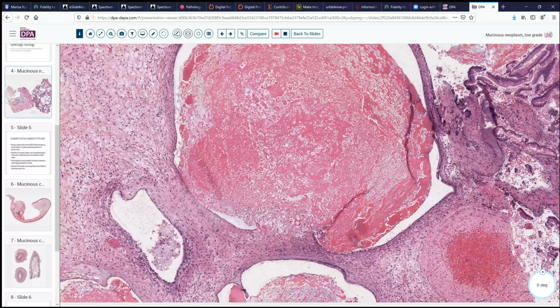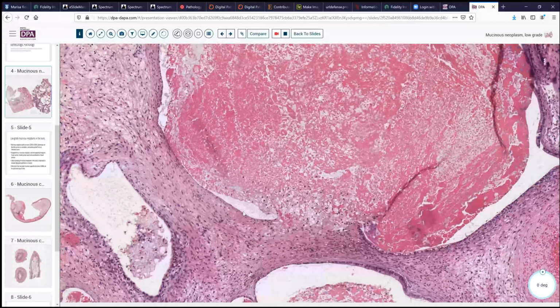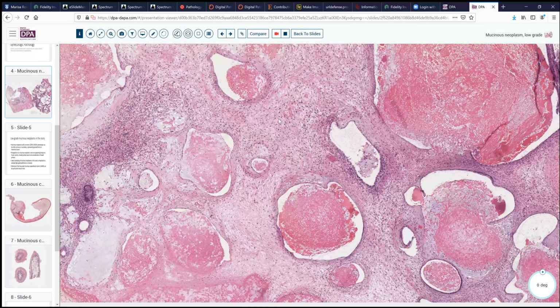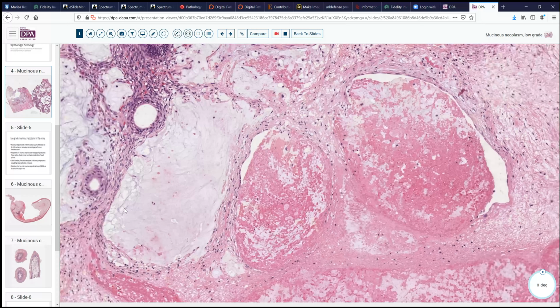We've got some incomplete glands, as we see here. Epithelium comes around here, comes around, and then it starts to disappear, and we have this eruption of fibrin, blood, and inflammatory cells back into the lumen. Then we pick up the epithelium again here. So this is a classic feature of sort of tumor-like diathesis that in some organs is the sine qua non of invasive neoplasia. Additionally, we see here that we have these pools of mucin.